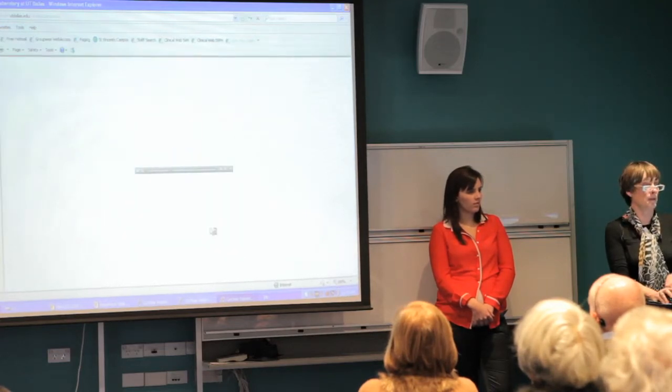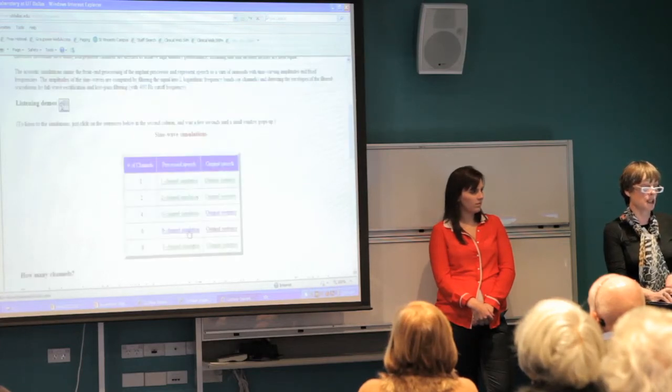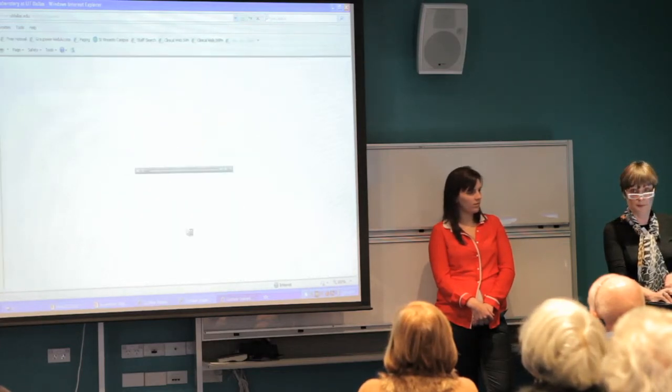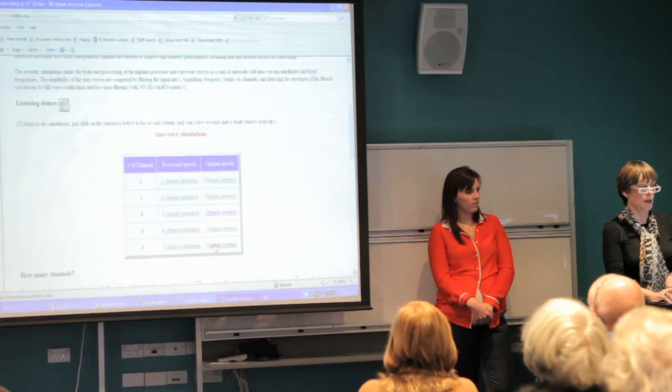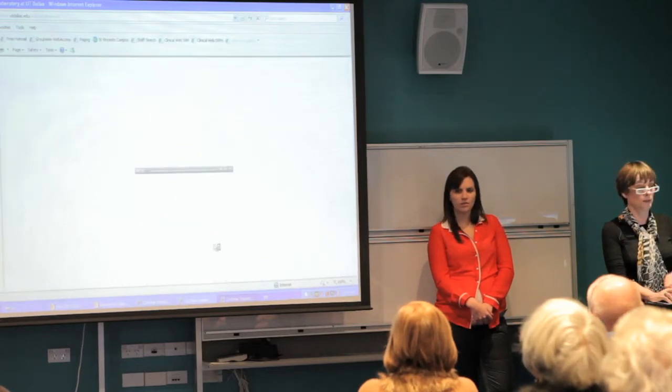A tree fell on the house. So this is 6 channels. A tree fell on the house. 8 channels. Her husband brought some flowers.